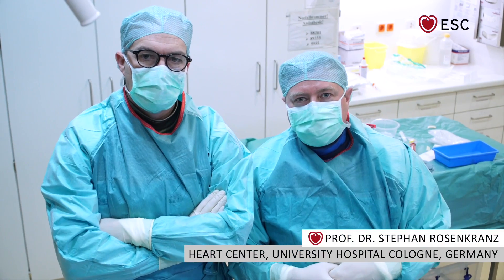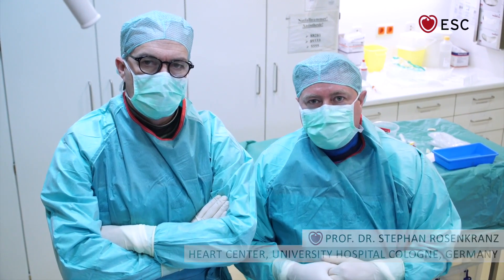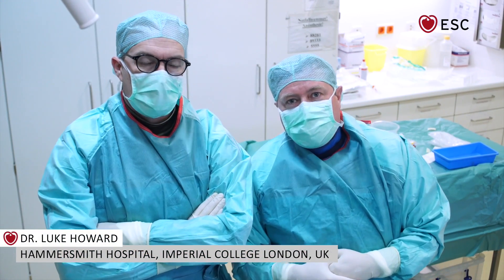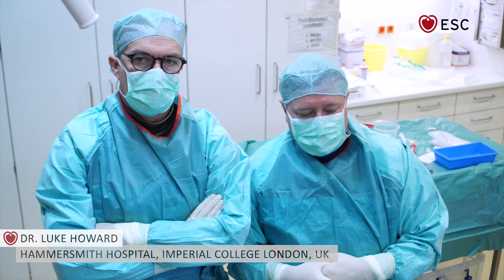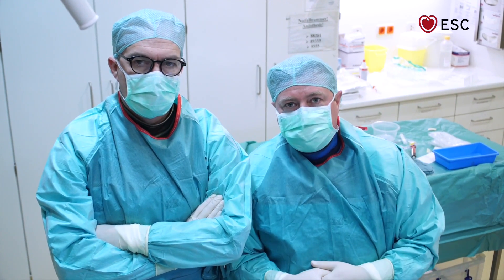Hello everyone, my name is Stefan Rosenkranz from University Hospital Cologne, and together with my colleague from London, Luke Howard from Hammersmith Hospital Imperial College, we will show you how to do a right heart catheterization today.